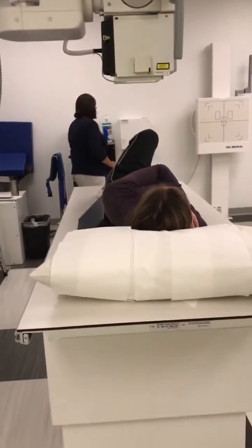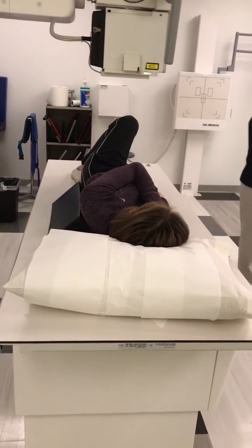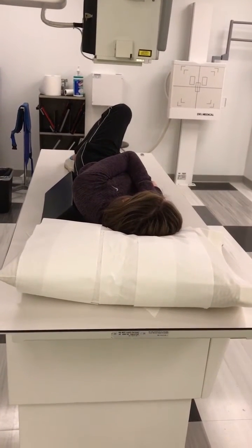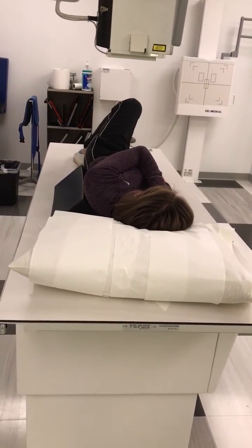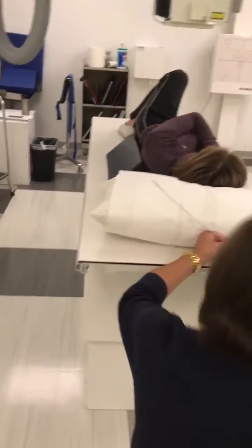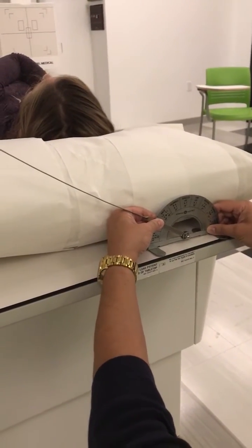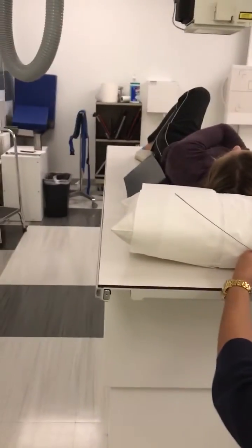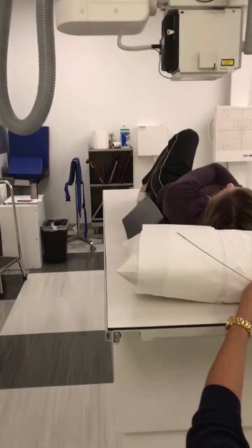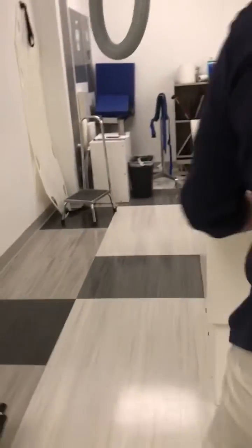And how are you going to know it's 30 degrees? Well, when you practice, get out this little instrument, find 30 degrees, and judge for yourself. What do you think, Brian? It's a little too much. A little too much. I think so too. I think I've rotated my patient just a smidge too much.